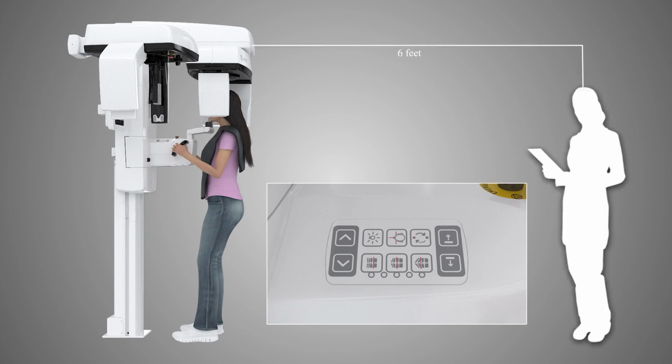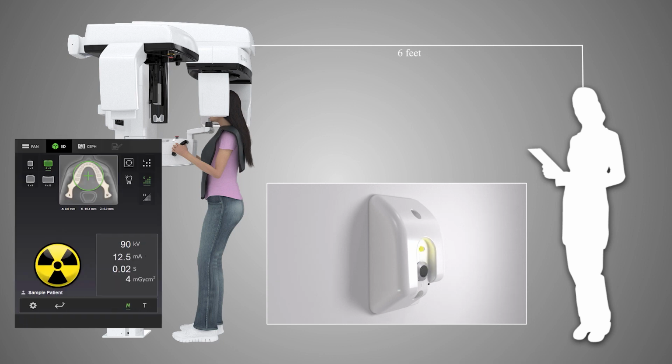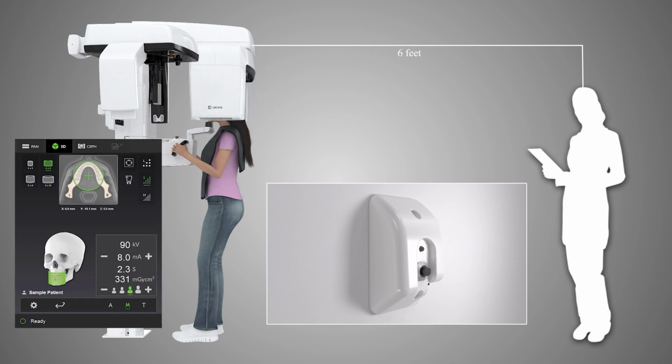Move a safe distance away of at least 6 feet or behind a suitable X-ray shield while maintaining line of sight to the patient during exposure. Press and hold down the exposure button. The rotating unit rotates around the patient's head. An audible signal and the exposure warning symbol on the touchscreen will appear. Once the image has been acquired, the rotating unit and the audible signal stop.